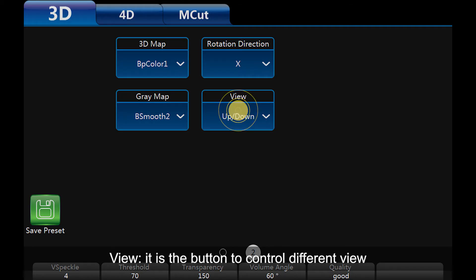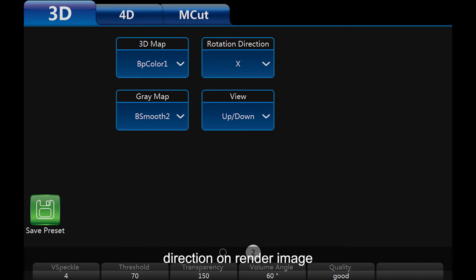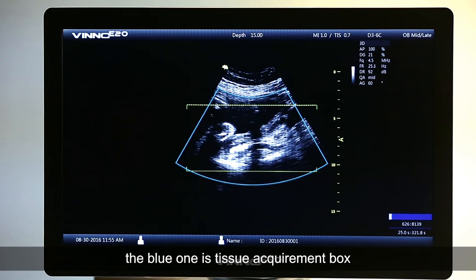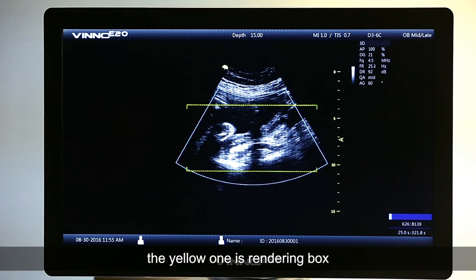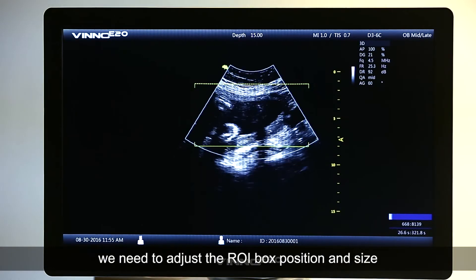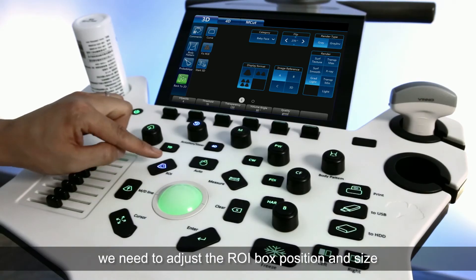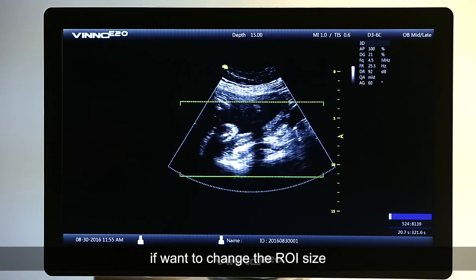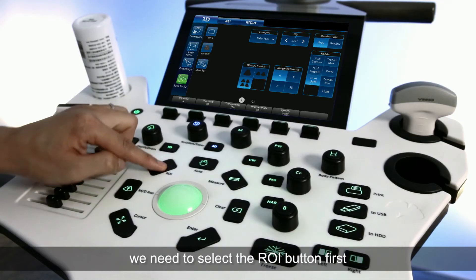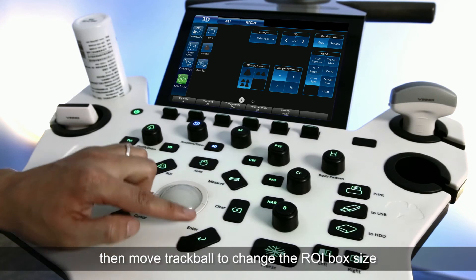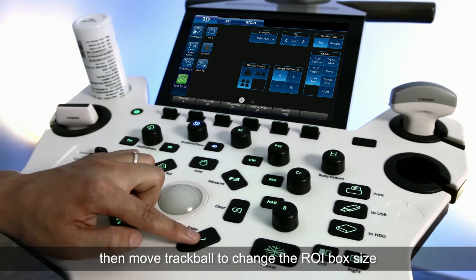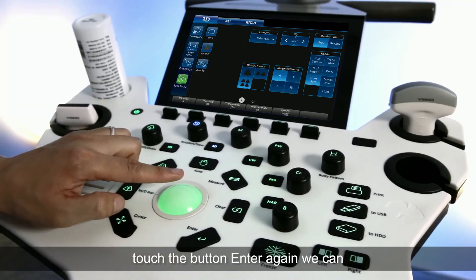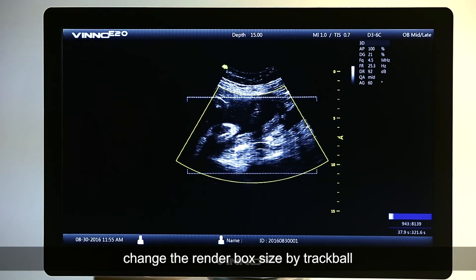View: controls different view directions on the render image. The render ROI box includes two parts — the blue one is the tissue acquirement box, and the yellow one is the rendering box. When we start scanning, we may need to adjust the ROI box position and size. Move the trackball to move the ROI position. To change the ROI size, select the ROI button first, then move the trackball. Touch the Enter button to activate the render box (yellow box), and touch Enter again to change the render box size using the trackball.